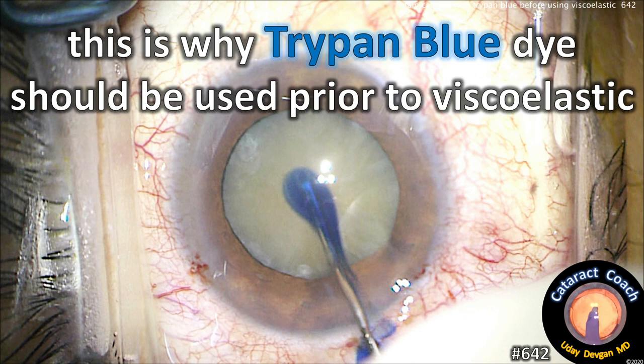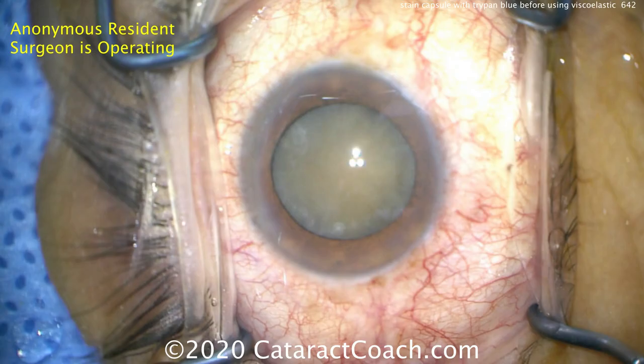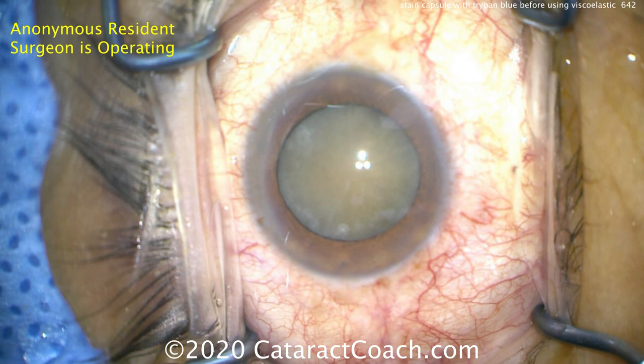CataractCoach.com. This is why TriPan Blue Dye should be used prior to viscoelastic. Let me show you.